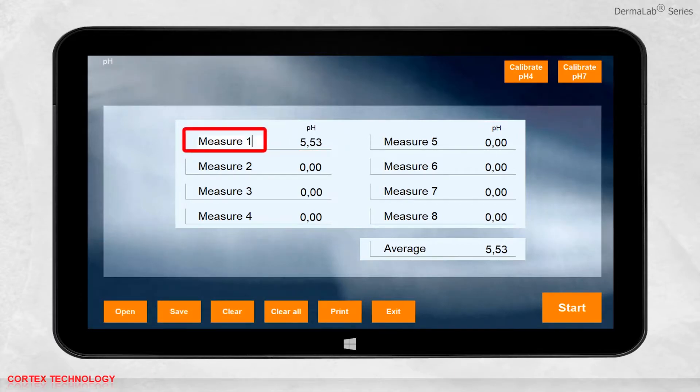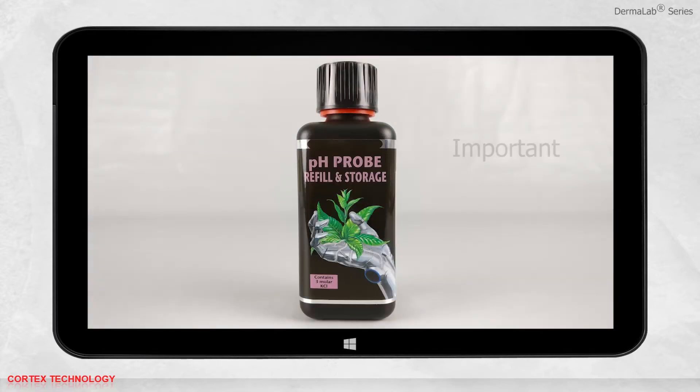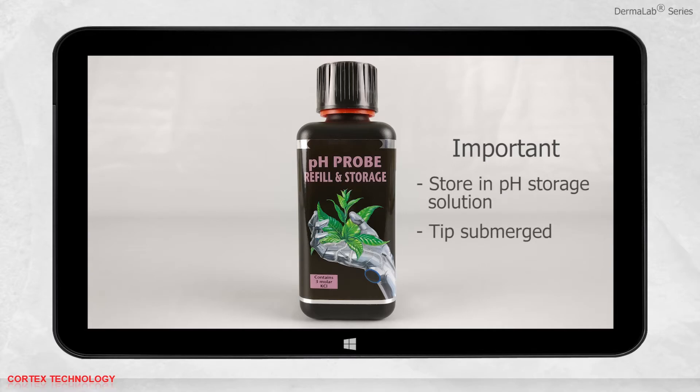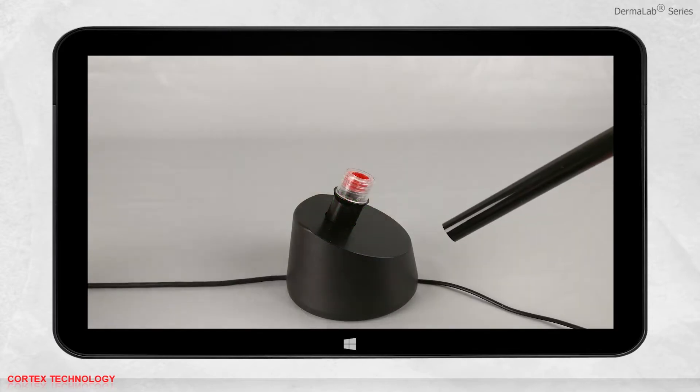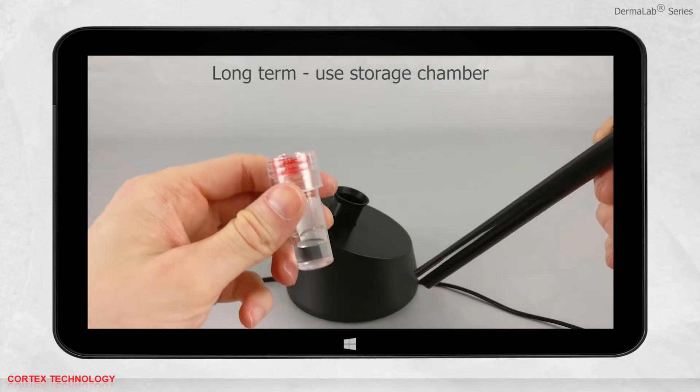Hold the probe on the location until the measurement is complete and the display turns black. You can change the name of each measurement. When you take multiple measurements, the average result will be calculated. You can save, print, or open previously saved data. When you are done using the probe, it is important to store it correctly in the pH storage solution. Submerge the probe tip in the storage buffer, which comes with the probe. For long-term storage, we recommend using the storage chamber.